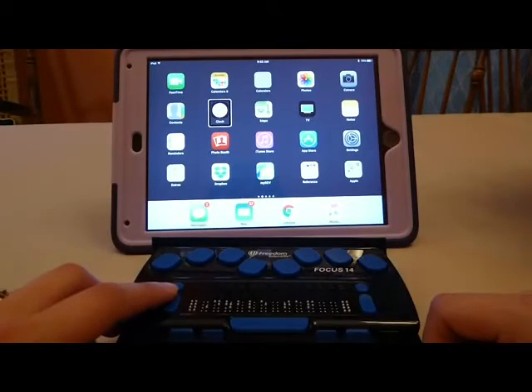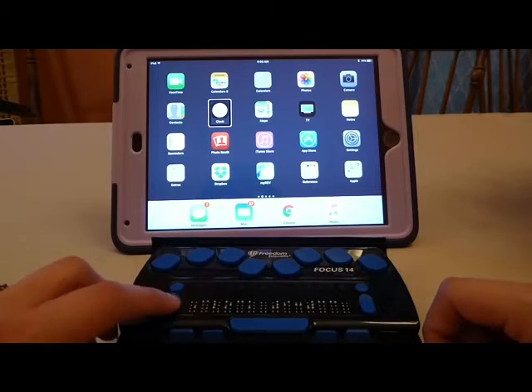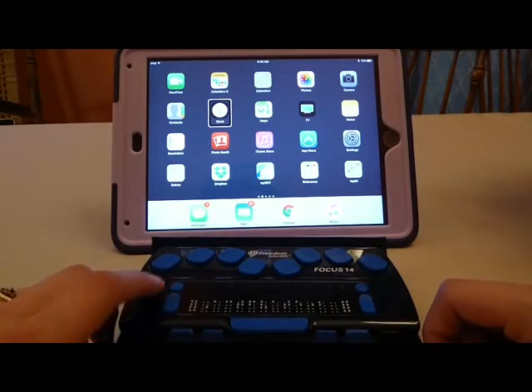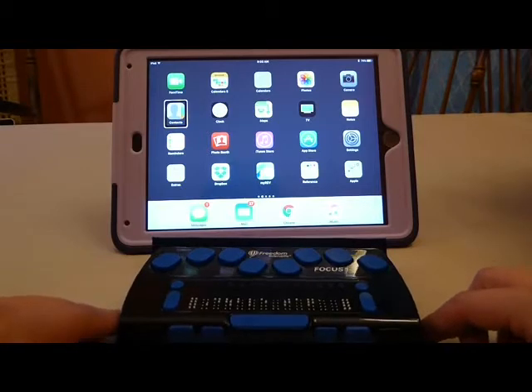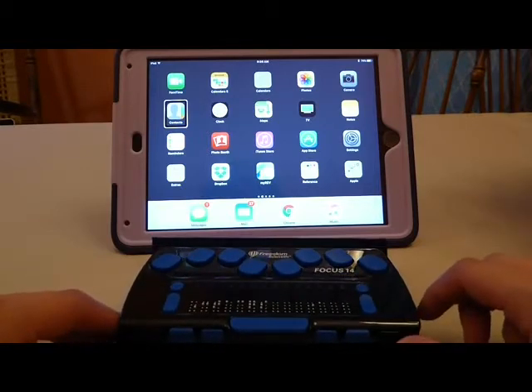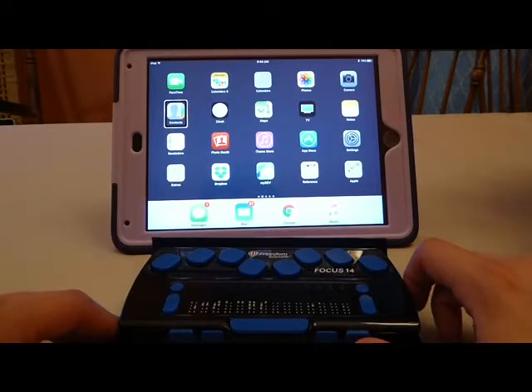My left nav rocker acts as a single finger flick up or down. So on my home page, that's going to offer to rearrange apps. If I was editing a document, it would let me move through whatever my rotor setting was set as. So if I had it set as lines and I pushed up and down on my left nav rocker, it would let me move by lines. The rocker bars on the front panel of my Focus act as three finger flicks. So if I use the right rocker bar, it acts as a three finger flick to go to the next page if I go down.